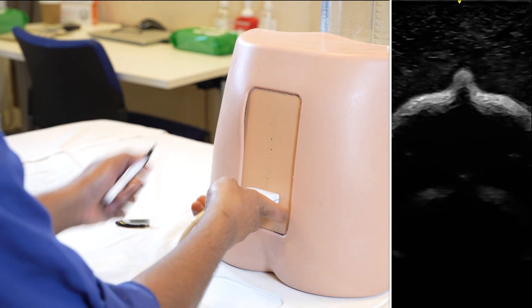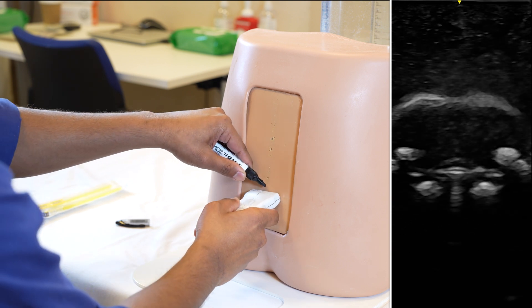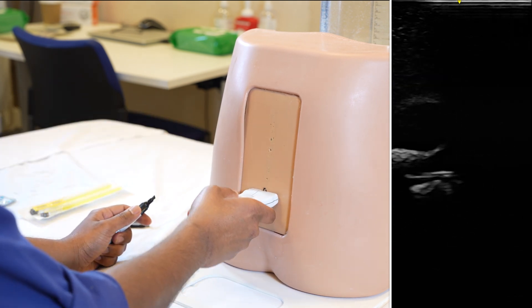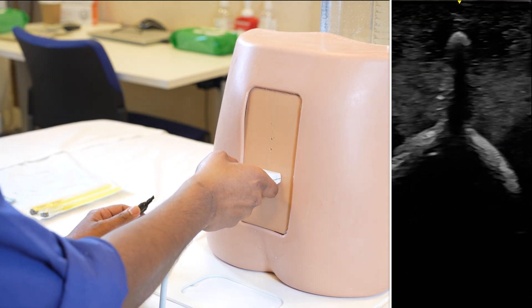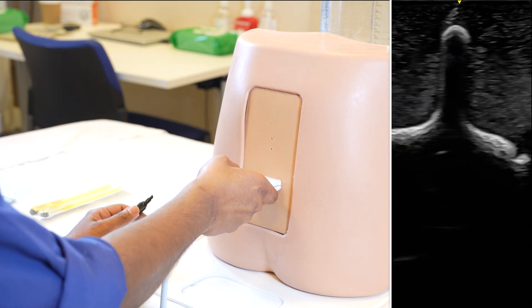We will just mark that with a marker — that is the sacrum level. The next thing is to try to find out the L5, which is the first hyperechoic hump that I get above the sacrum.